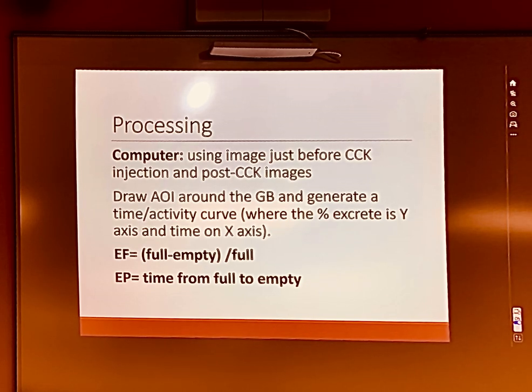So like everything with the old cameras is better for that reason? You could scan the patient under the wrong name, and you just pick it. Oh, I scanned John under Alexis. All right, well, the resting says John and the stress says Alexis. The camera will go, hey, it's two different patients. You go, I know, okay. And it just lets you do it. And then you label it appropriately.